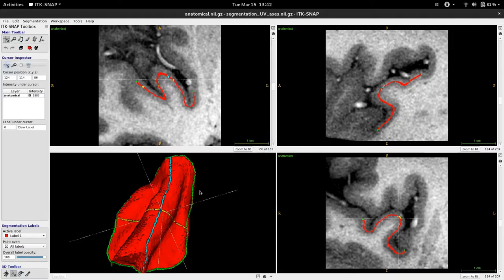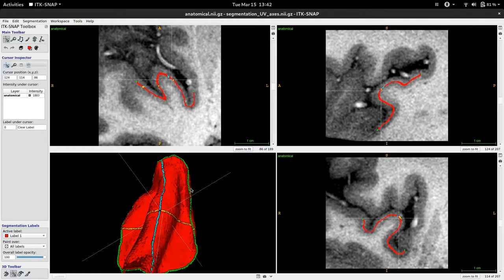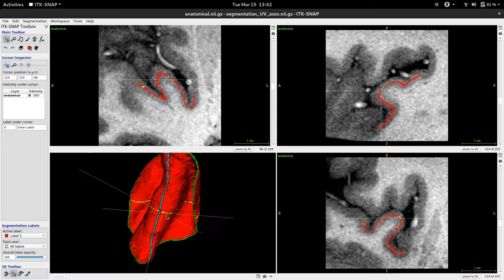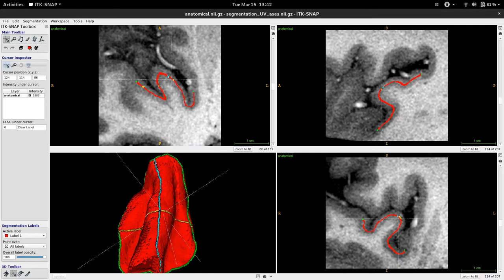Just to quickly remind you, we ended up computing our axes by using the ln2_multilaterate program. And at the end, we end up seeing the following representation for Heschel's gyrus. You can see that one axis runs along and the other one runs across Heschel's gyrus. This axis organization is found automatically by ln2_multilaterate. However, if you want to position these axes differently, there's an option to do so.